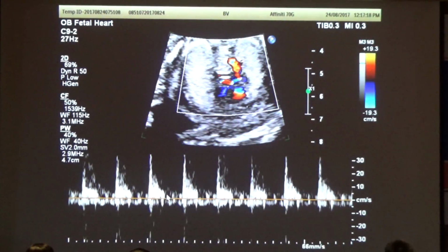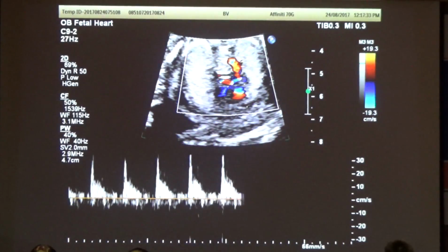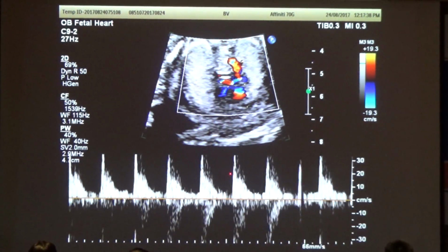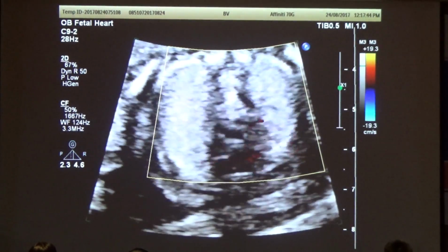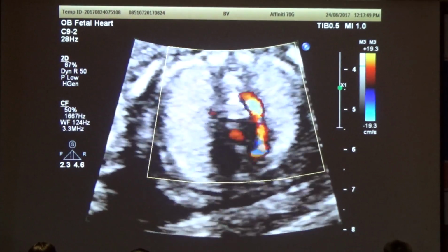We see that the upstroke is very fast, meaning the heart is pumping very well, but on the other side of this line is the pulmonary vein. You see, with an E and an A, E and A. It's not the best pulmonary vein signal, but it's good enough. So we know that there's a beautiful artery signal. That is characteristic of what you see after birth with pulmonary hypertension. The pulmonary artery spectrum is very good, it pumps up very well and then falls. There's the whole main pulmonary artery going to the ductus.